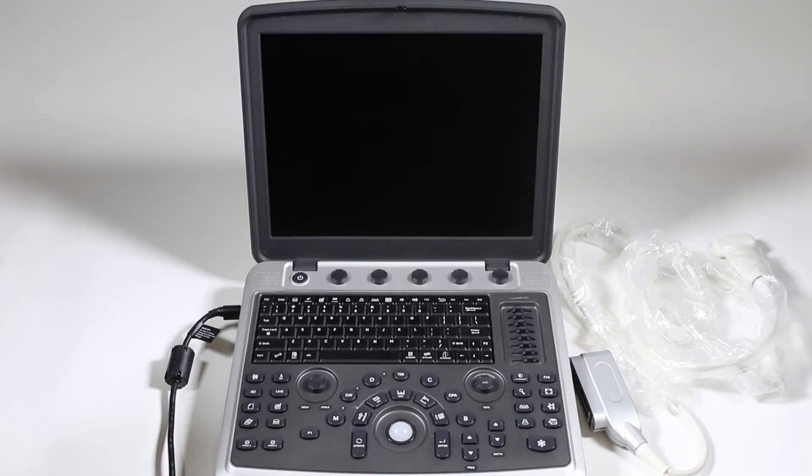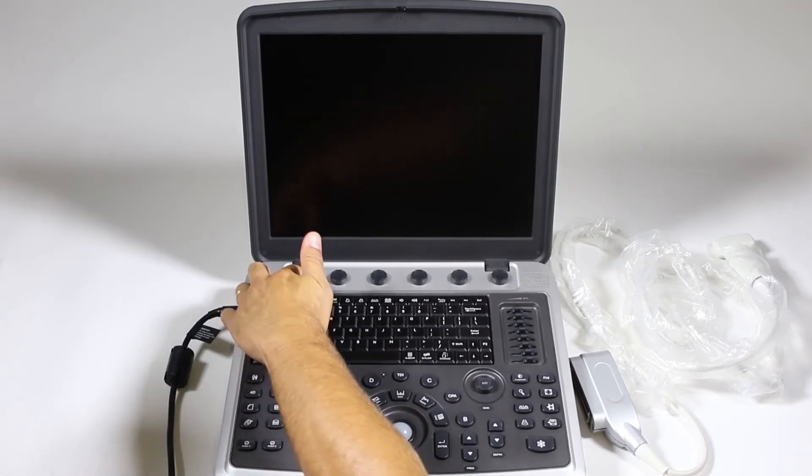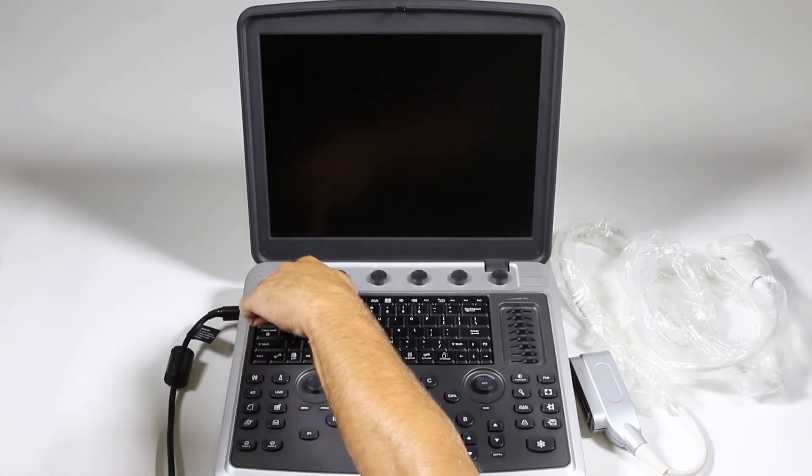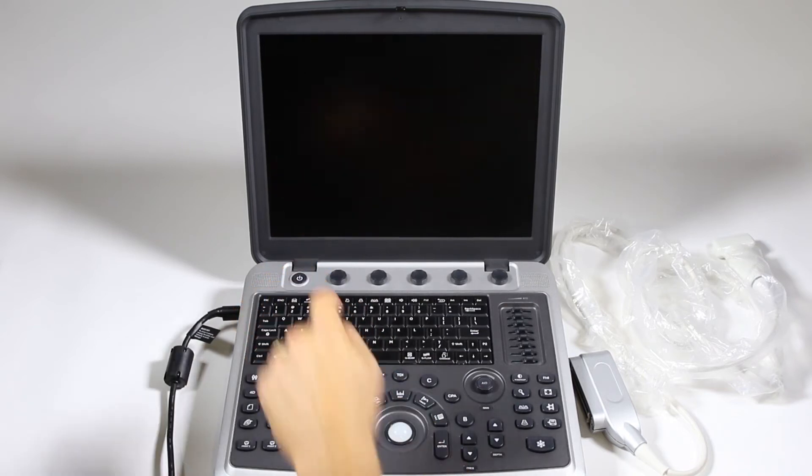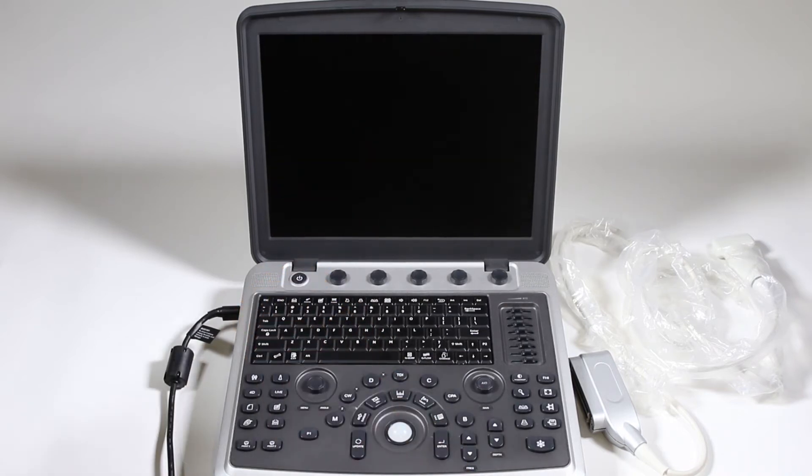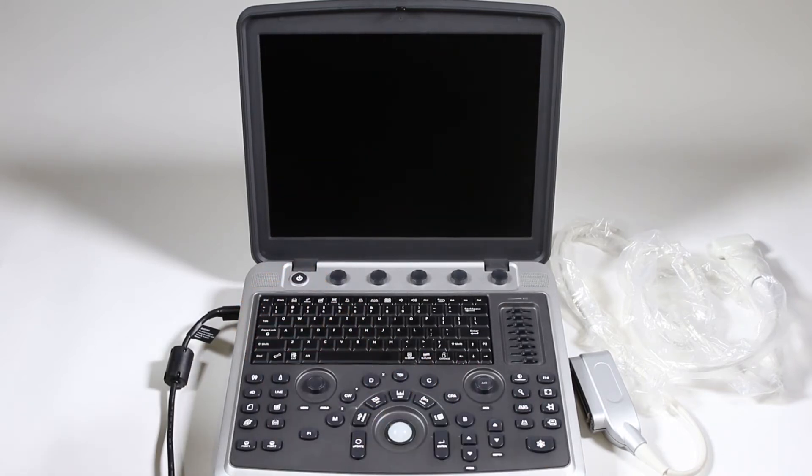Hi, and welcome to Providian Medical's Chison Sonobook 9 Ultrasound Training. Let's get started. Press in the power button right up in this upper left hand corner. Hold it for a moment and the keyboard will light up and you'll hear it start up.